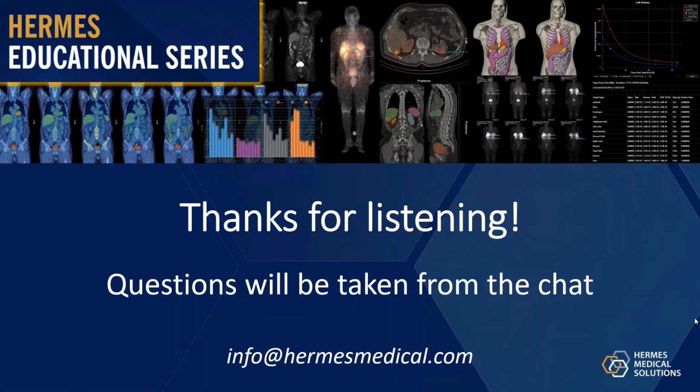Okay, we have a second question from Layla. What is the influence of the calibration factor on the calculated dose? As I understand, the calibration factor for high energy, I think, or for HE, is from 7.5 to 32.9. Yeah, it has a huge effect.